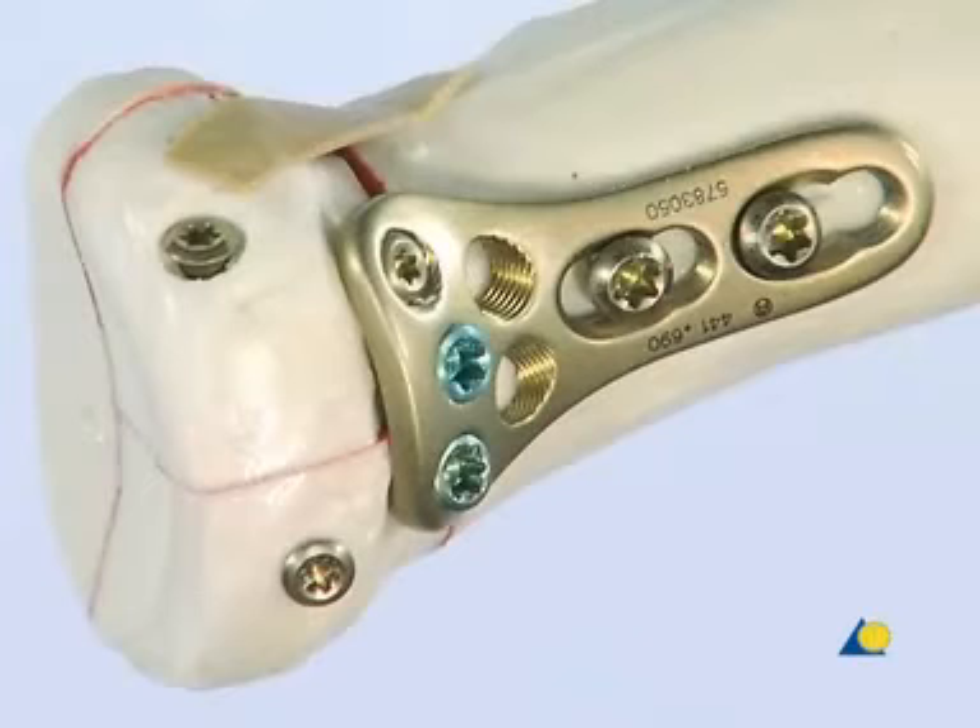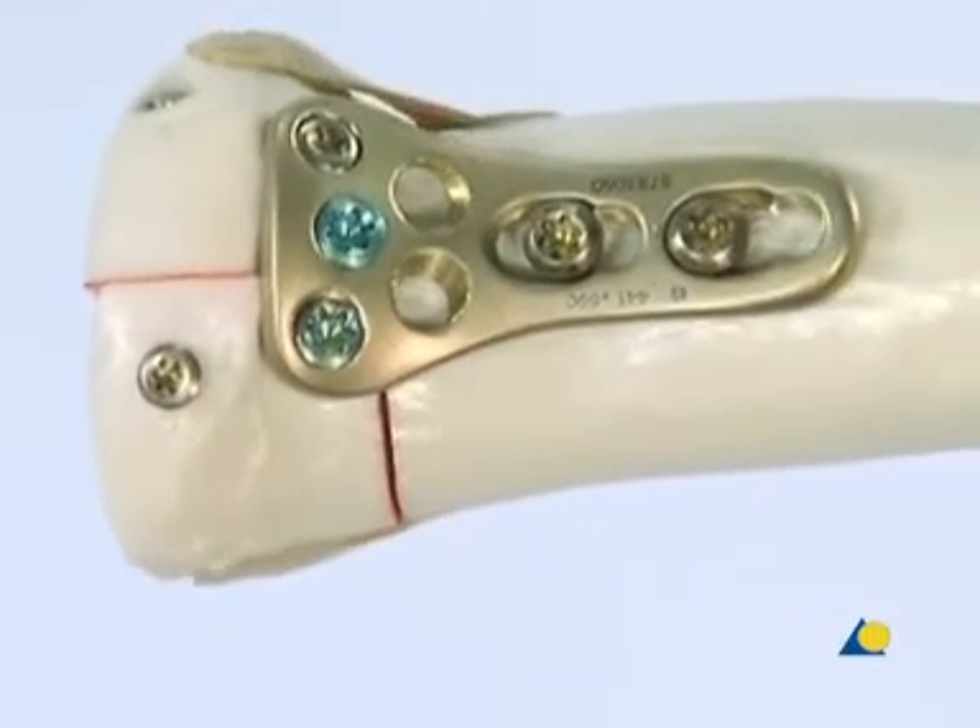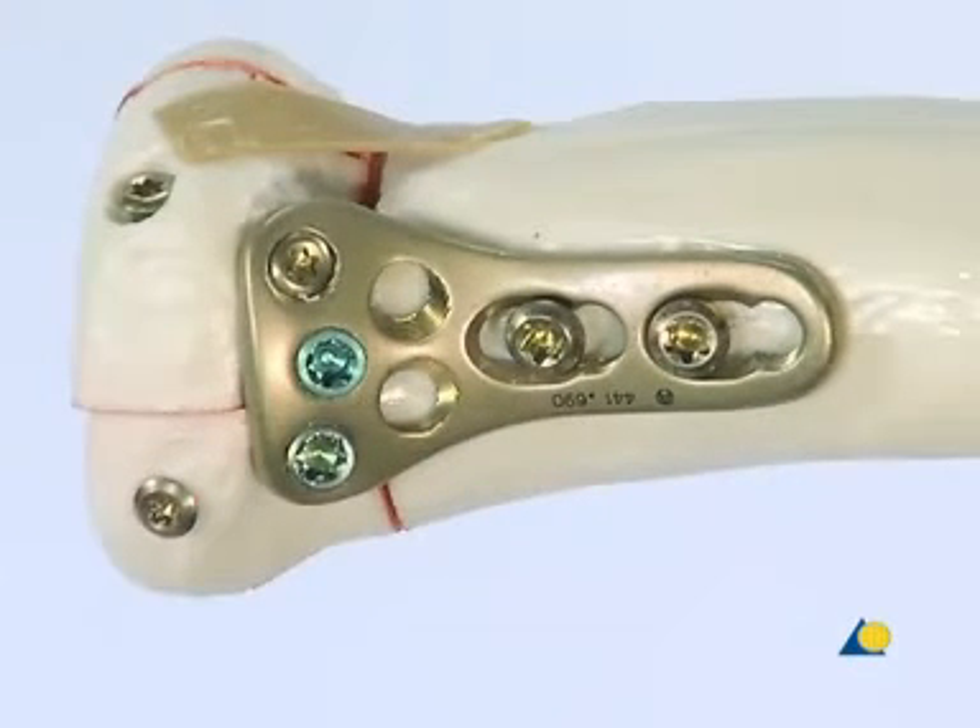The result of the fixation shows that the three fragments are aligned. The plate fixes the radial head to the shaft with good overall alignment. The plate is placed in the safe zone, distal to the radial head, and the first 2 mm cortex screw is recessed below the chondral surface. Often there is comminution in these fractures that does not allow a complete anatomical reduction. The radial head is not at 90 degrees to the shaft, but rather at an angle of 10 to 15 degrees. After the alignment has been accepted visually, fluoroscopy should be used to examine the elbow for stability, and rotation should be visually inspected to ensure the plate or screws do not impinge on the annular ligament or collateral ligament.